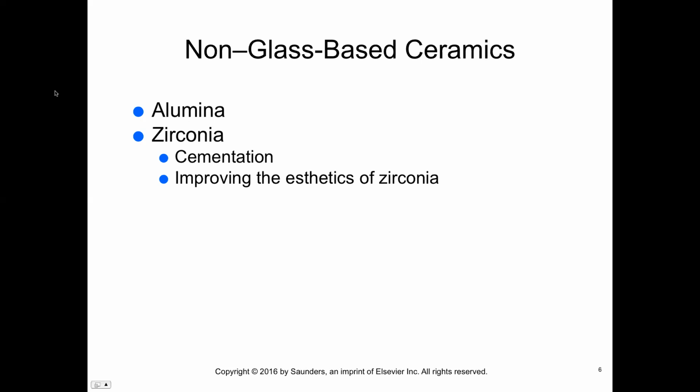Manufacturers have developed primers for preparing the interior of the crown for cementation. Zirconia is a much more opaque ceramic than lithium disilicate ceramic. To achieve better aesthetics, a layer of veneering porcelain can be added to the zirconium core. If fracturing occurs, it's usually caused by a fracture of the porcelain veneer or separation in the porcelain from the zirconia. Zirconia has only been out for a couple years now.